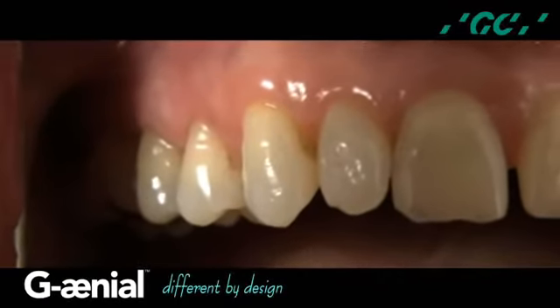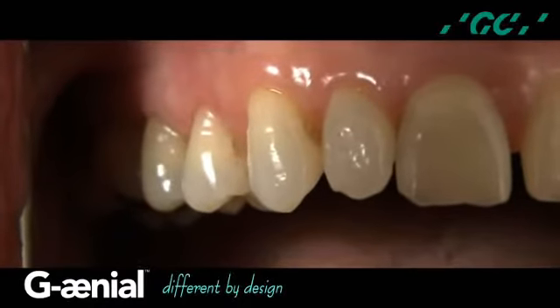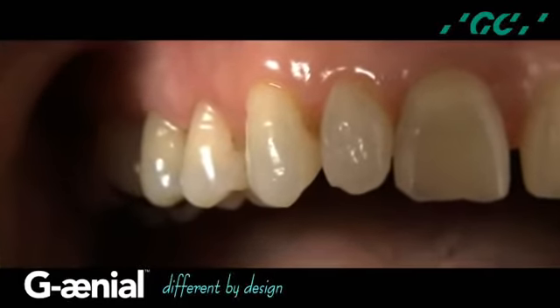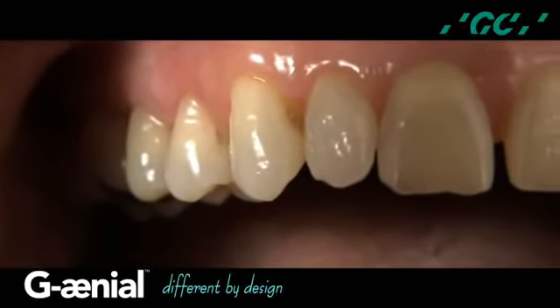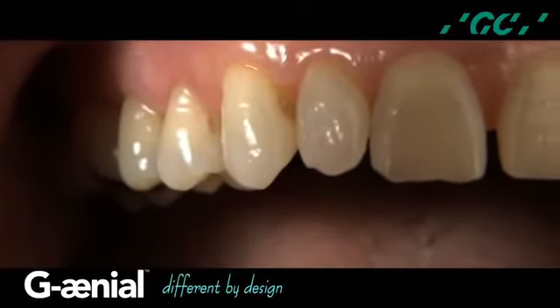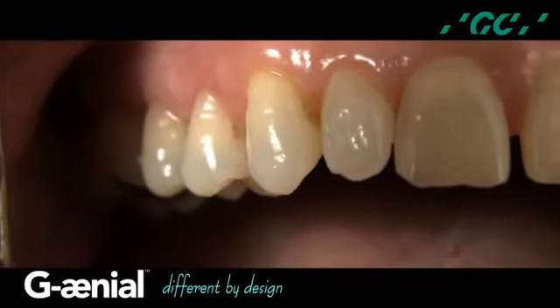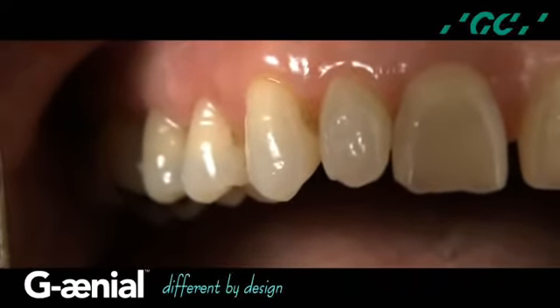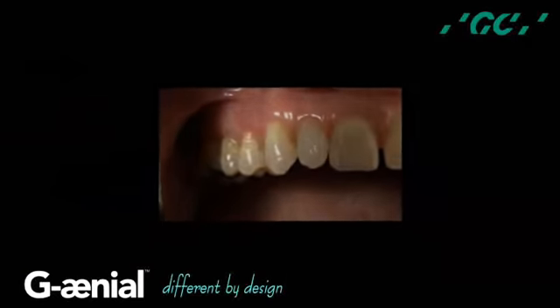Natural light dynamics are evident in the definitive direct resin restorations using G-ænial Universal Flo. The completed Class 5 composite restorations demonstrate enhanced smoothness, color, and a harmonious integration of form, function, biocompatibility, and aesthetics at the dento-gingival complex.